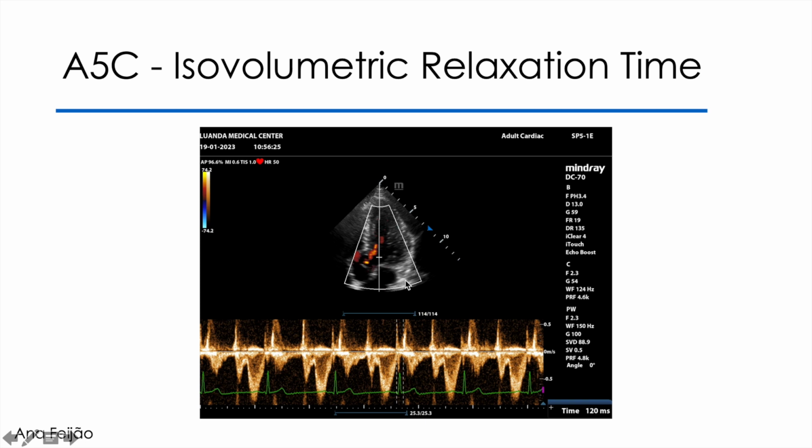To evaluate a specific zone, I call the Doppler PW sector. I set the sample to 1.5 to 2 millimeters and place it in the middle of the two streams, here. I press PW again to call up the velocity graph.